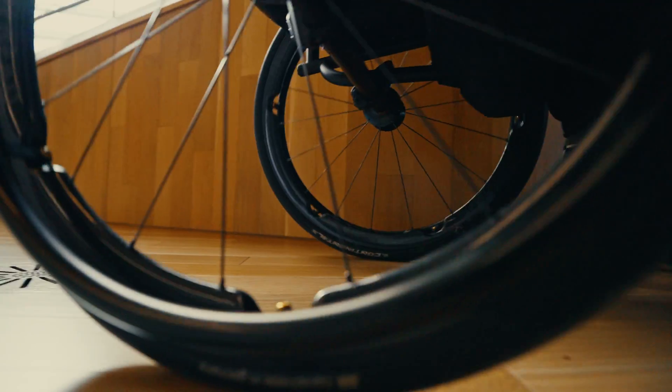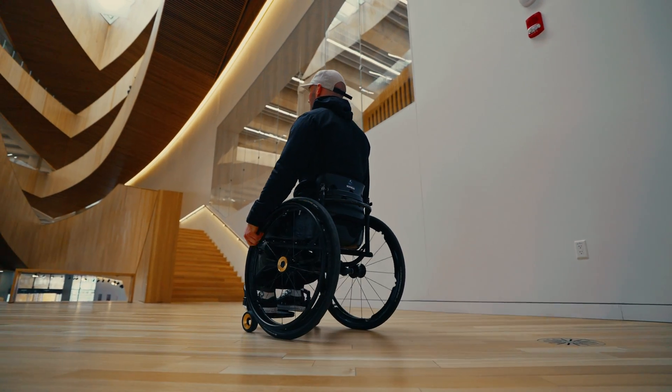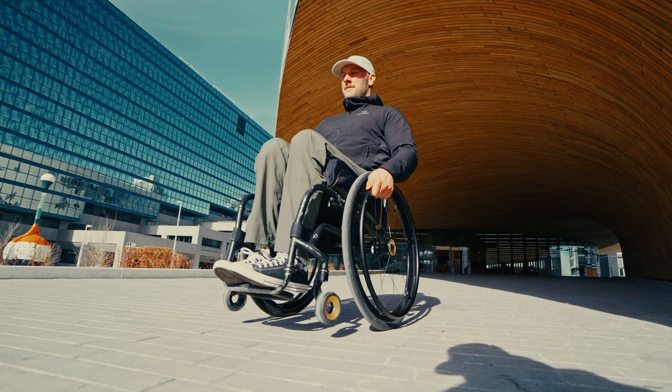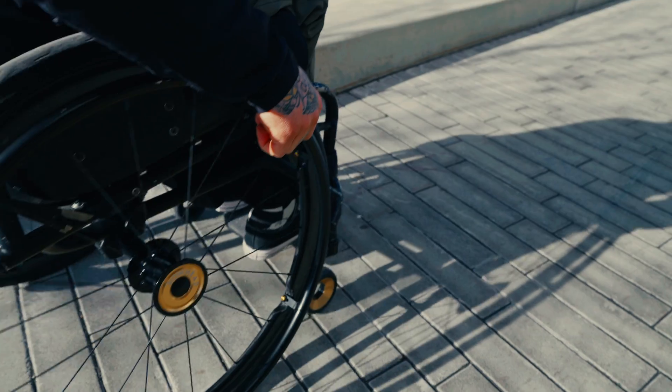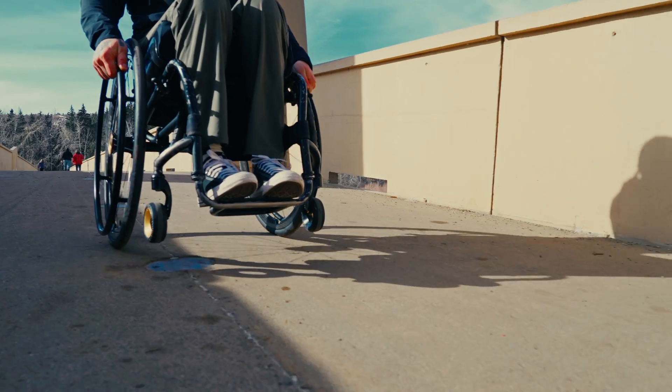Described as the all-season, all-rounder, the Grand Prix comes in at a nice lightweight of 250g, giving you complete confidence in tyres that will last for many, many miles. The Grand Prix features their proprietary Black Chili rubber compound for optimized grip, lower rolling resistance, and increased durability.